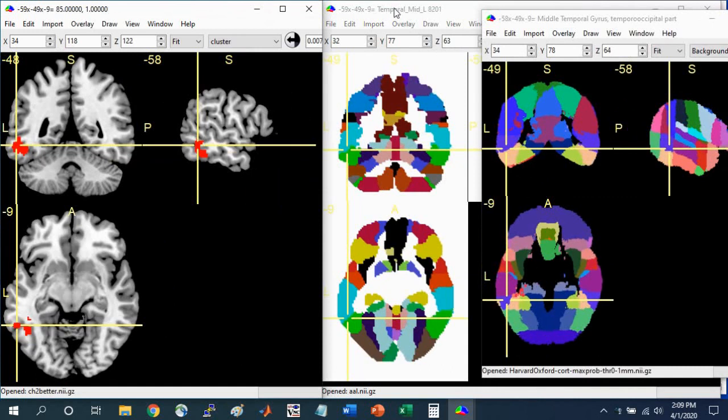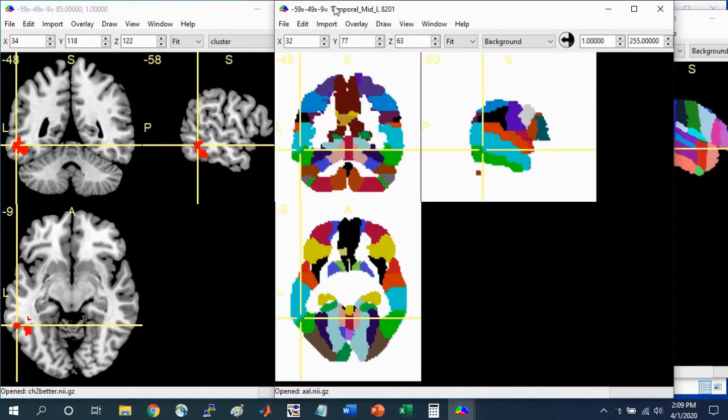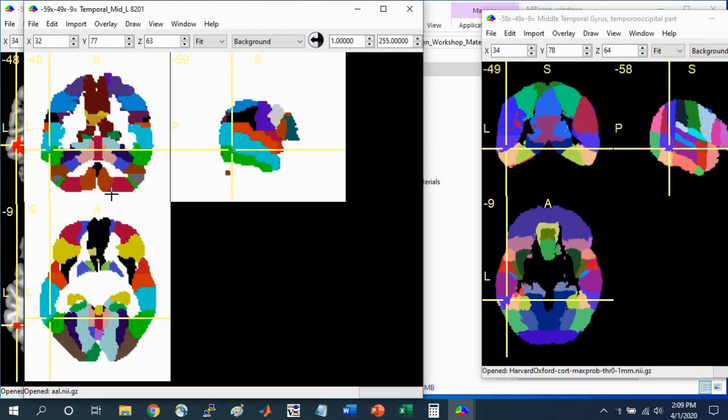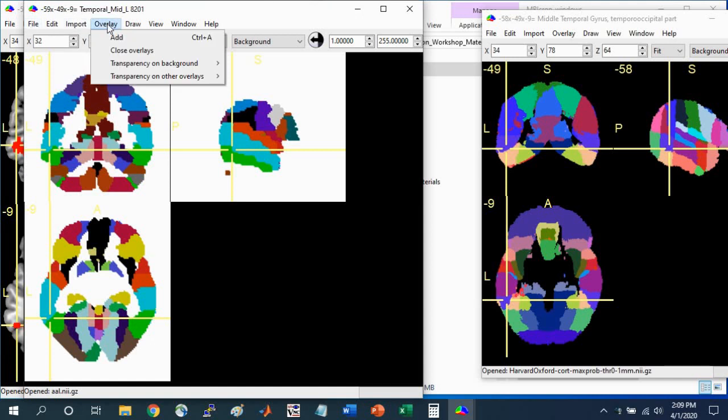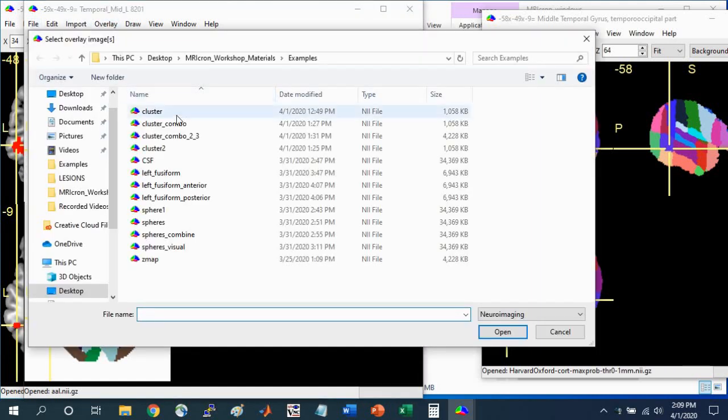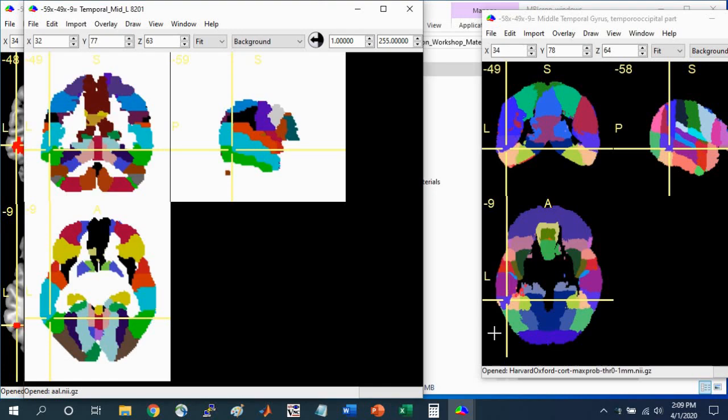Another way is actually to overlay the volume on the Atlas itself. When you have the underlying image as the Atlas, you can go to Overlay, Add. We can select this cluster, and we can see it show up here.